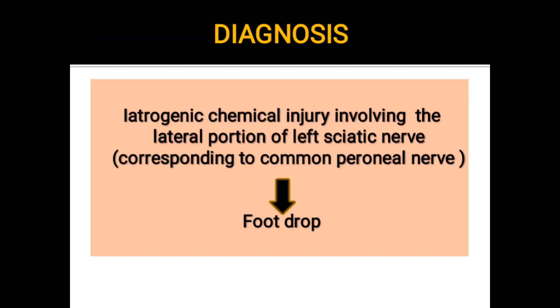The diagnosis is iatrogenic chemical injury involving the lateral portion of the left sciatic nerve, corresponding to the common peroneal nerve component. That is the reason the patient developed foot drop following intramuscular injection. This is why intramuscular injections should always be given in the upper outer quadrant of the gluteal region, as the sciatic nerve lies in the lower inner quadrant. This case highlights how precisely high-resolution ultrasound can delineate the minute morphological changes of peripheral nerves, thereby aiding in arriving at an accurate diagnosis.